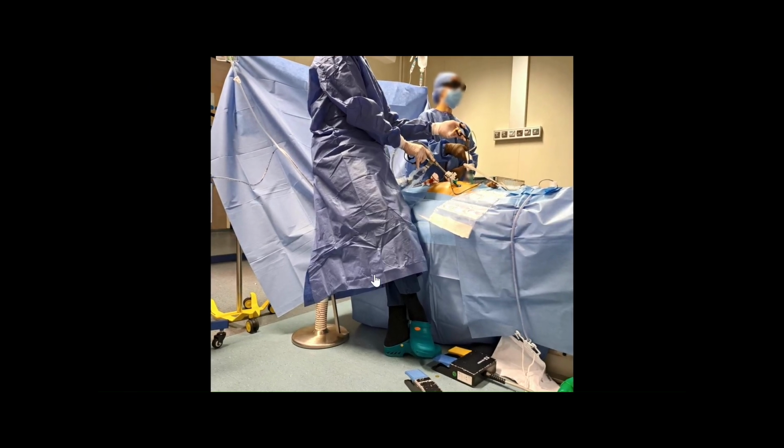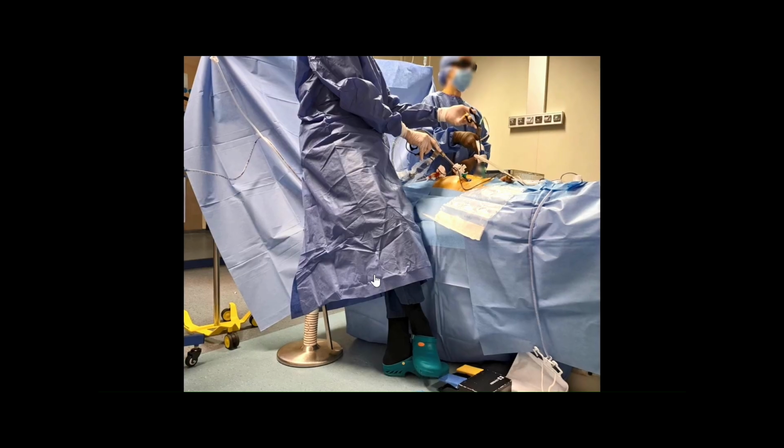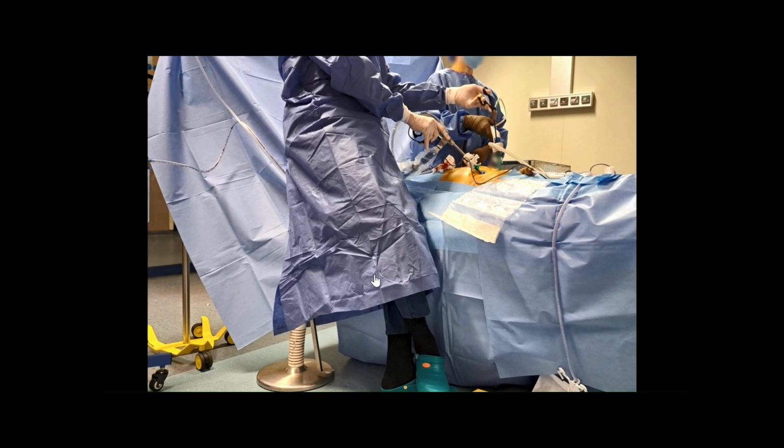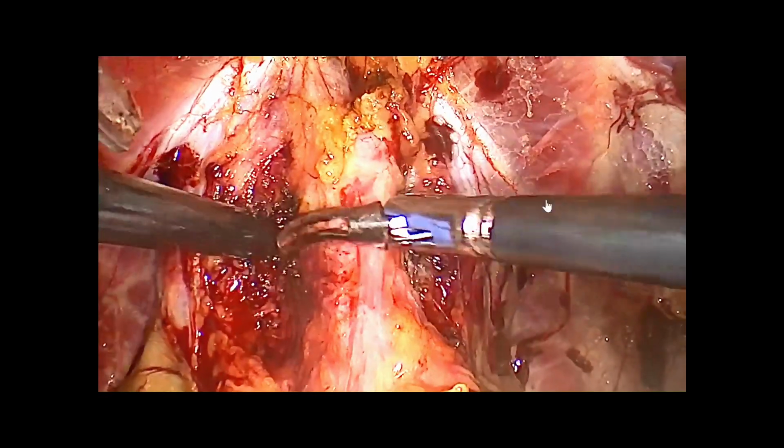And you see, I'm sitting on a saddle. I'm really comfortable, and it's always very important to have this for smart laparoscopy, as I said.